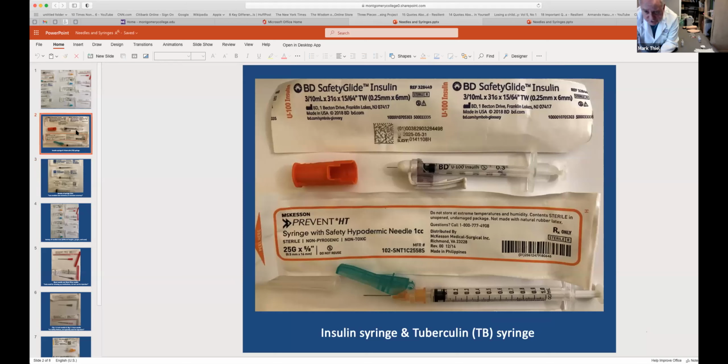The next type of syringes that we're going to be looking at are two specialized syringes of note. First is that you cannot choose the needle as the nurse in these cases. You can't remove them. So for an insulin injection or TB injection, you do not use the blunt system of a pre-drawing needle. Just use this needle to both withdraw the medication and inject the medication.